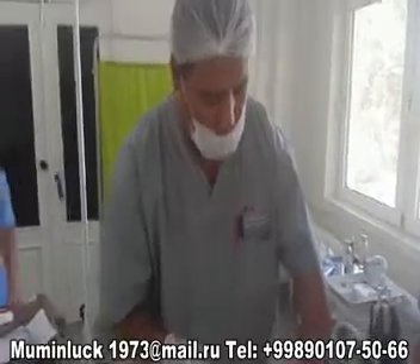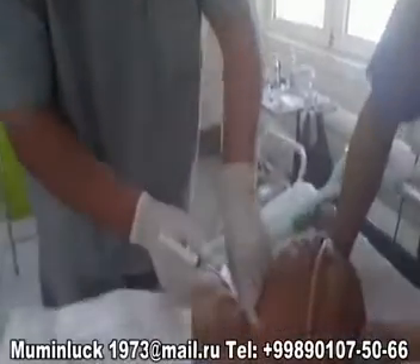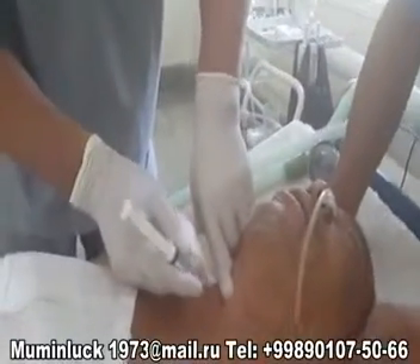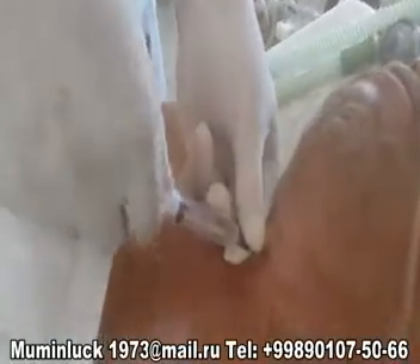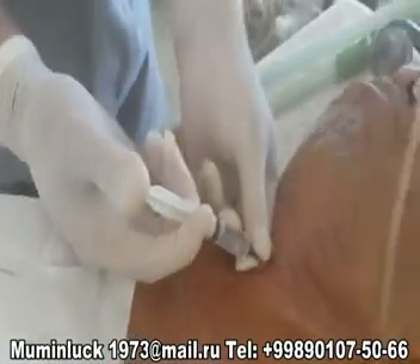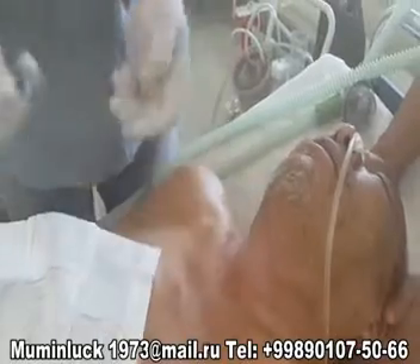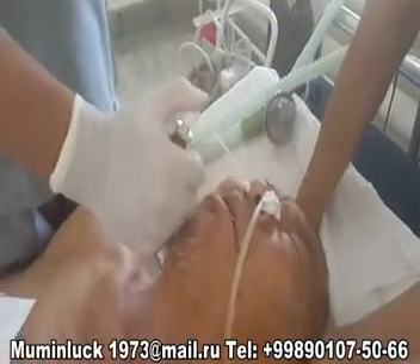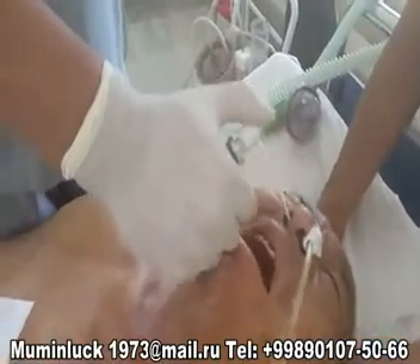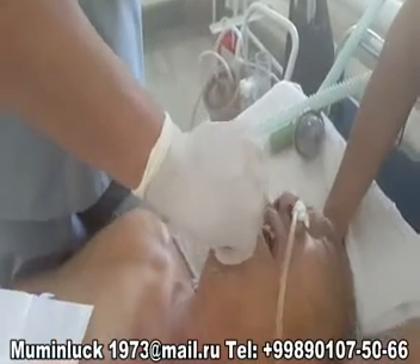After puncturing the cricothyroid membrane, we instill three or four milliliters of two percent lidocaine into the trachea. This results in coughing by the patient, which leads to fine anesthesia of the tracheal mucosa. We then insert the tracheal tube through the nasal cavity.